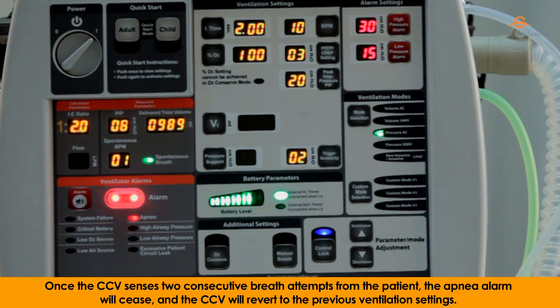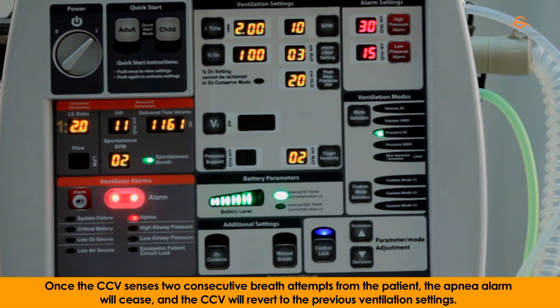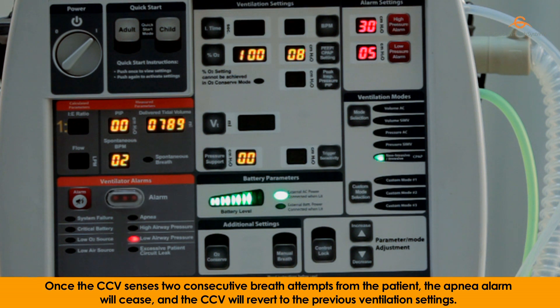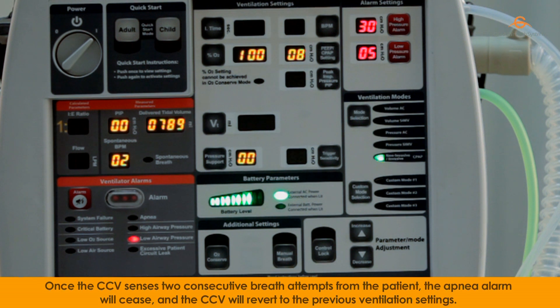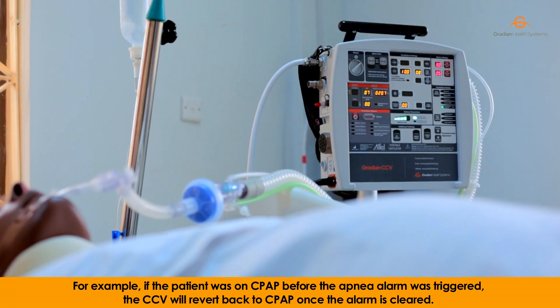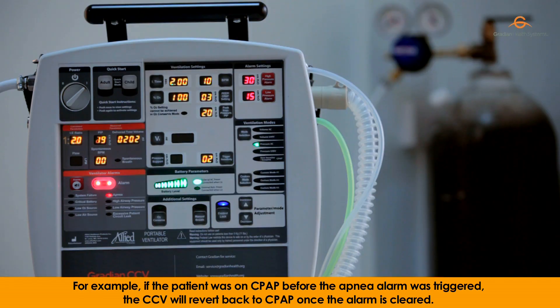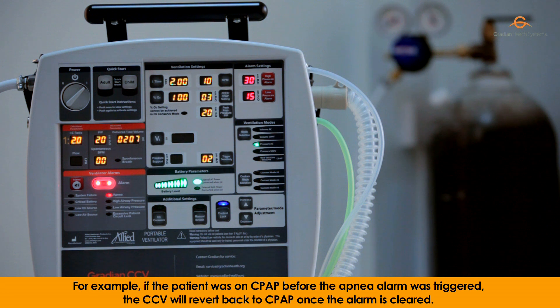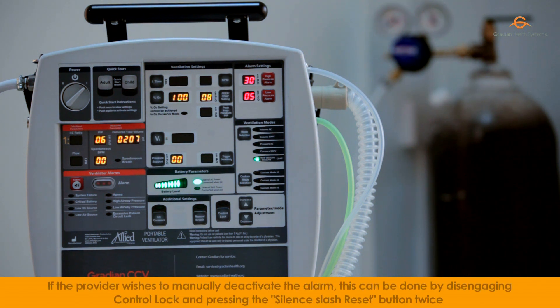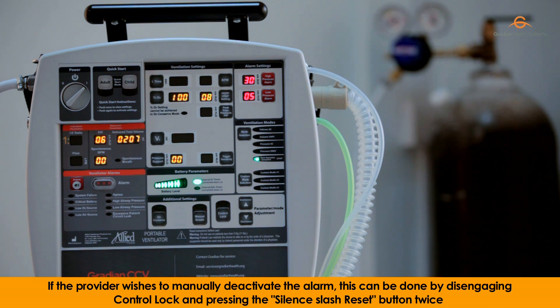Once the CCV senses two consecutive breath attempts from the patient, the apnea alarm will cease and the CCV will revert to the previous ventilation settings. For example, if the patient was on CPAP before the apnea alarm was triggered, the CCV will revert back to CPAP once the alarm is cleared.